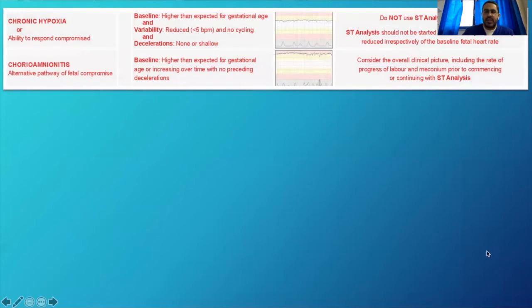Yeah, and this is basically, we're trying to figure out the babies that are not actually fit for labor. So a baby that is not responding from the beginning, from the moment we actually lay eyes on this trace, this baby is not responding, it's not behaving normally. We think that this baby has pre-existing brain damage or is in the process of getting pre-existing brain damage.